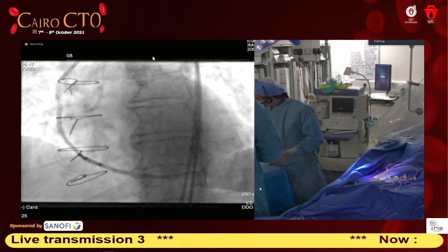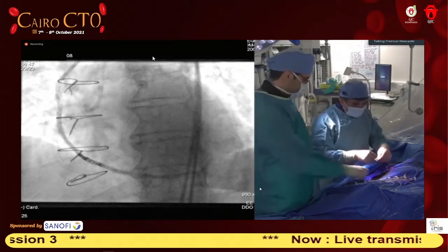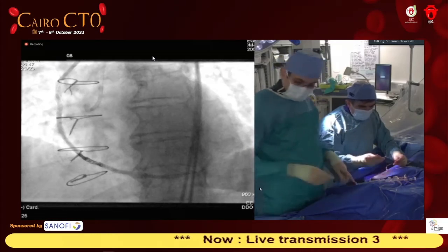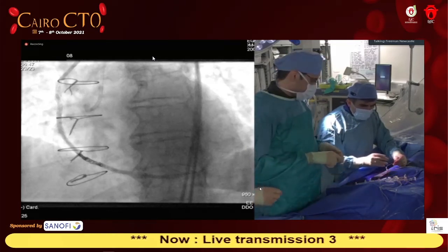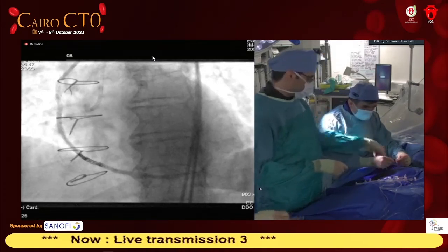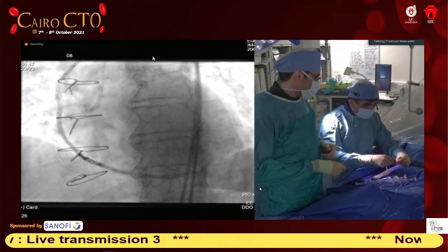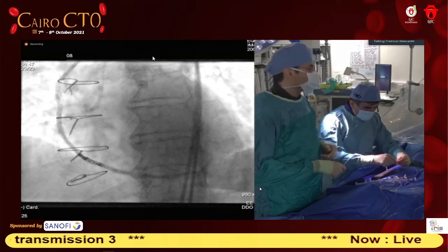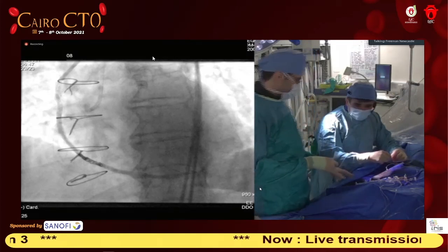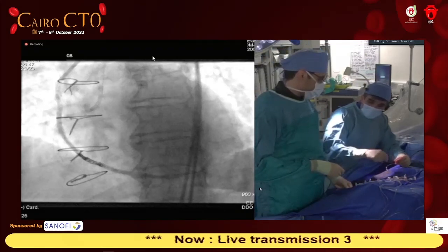No, they won't. I said the issue for me has never been about movement because of the stent. And also in a diseased vein graft, to be honest, they will stick, they will not move, but it's something you have to be concerned about when you're delivering them, and hence the controlled delivery with the stilette. I could show you that we could do this with the injection. You just take a 3 ml Luer lock syringe that comes with the catheter itself, fill it with saline and inject as hard as you can, like when you're doing the IMR or CMR.